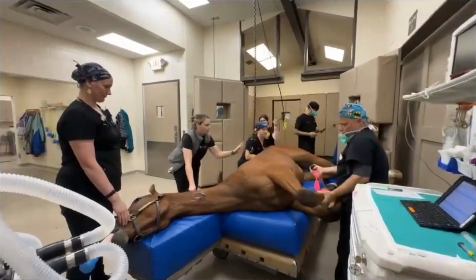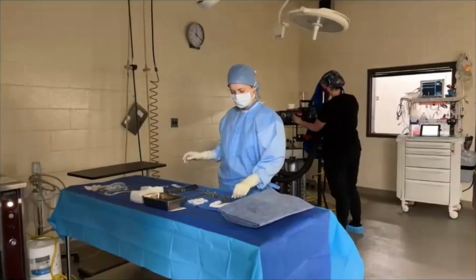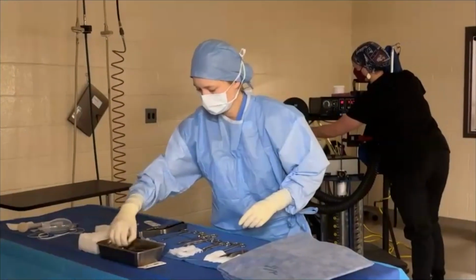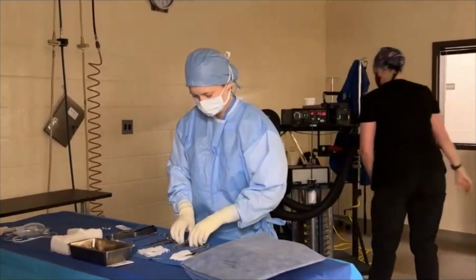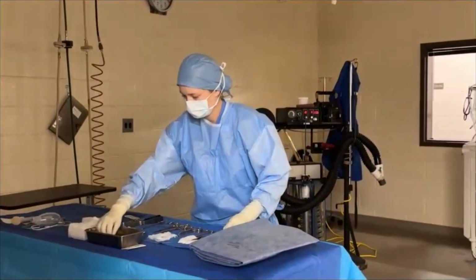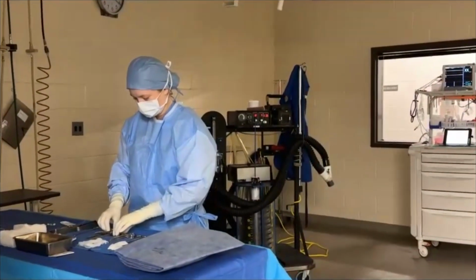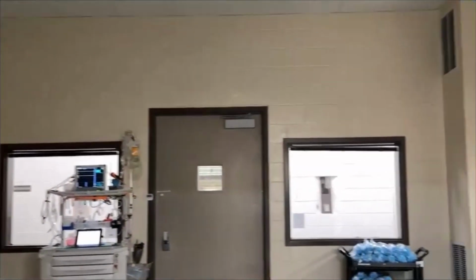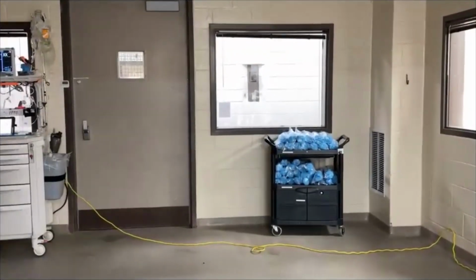So this is a horse in training that's having the surgery? Yes. Not a young horse. It looks like that was a racehorse. Yes. So it looks like you're getting all the surgical equipment ready and sterilized. Usually the surgeons at our hospital have an intern or a resident, sometimes both, working with us. They're just starting out in their careers and trying to learn the craft.